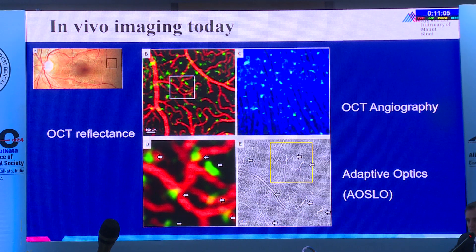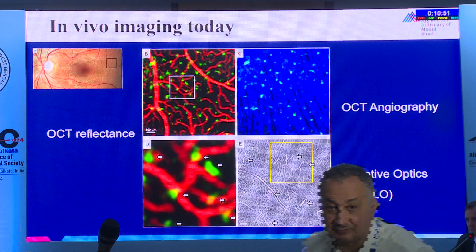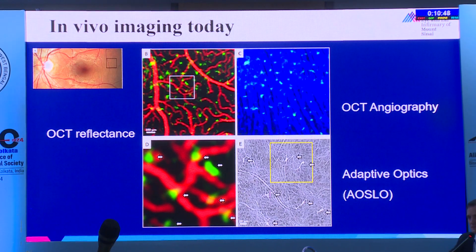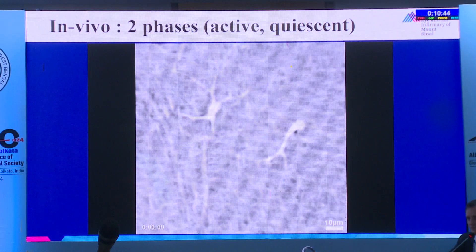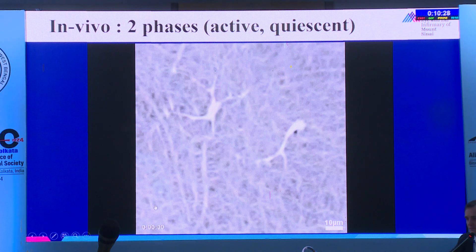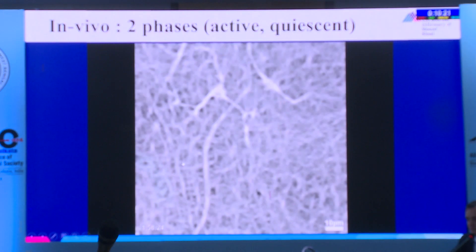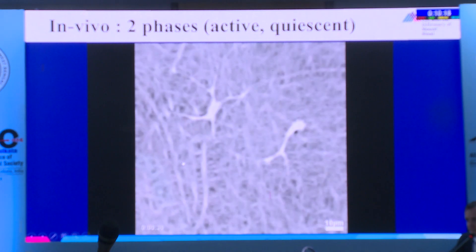Today we have great ability to image these cells—a highly magnified view showing the retinal vasculature with green representing individual hyalocytes, and adaptive optics providing super high magnification. The quiescent or inactive phase cell is spread out like a palm; the active phase cell is more consolidated and moves significantly on video, while the inactive one is spread out and barely moves.